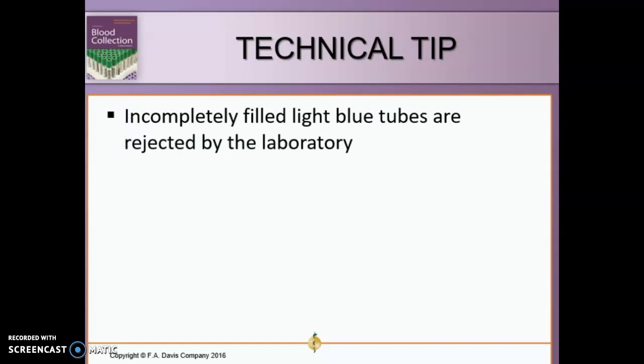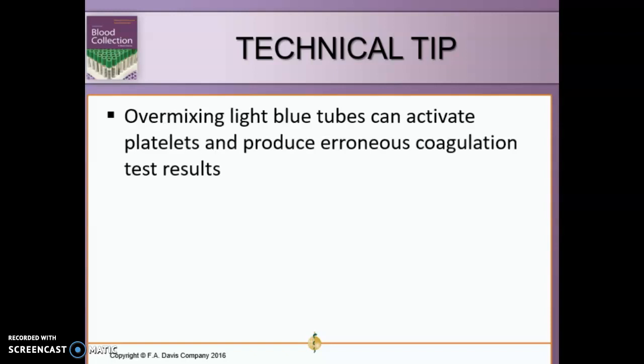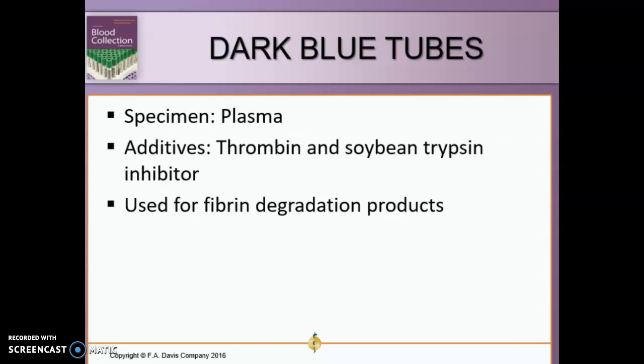Incompletely filled light blue tubes will be rejected. They'll send them back, so just know that. Overmixing light blue tubes can activate the platelets and produce an erroneous coagulation result, so we want to make sure that we don't overmix that.